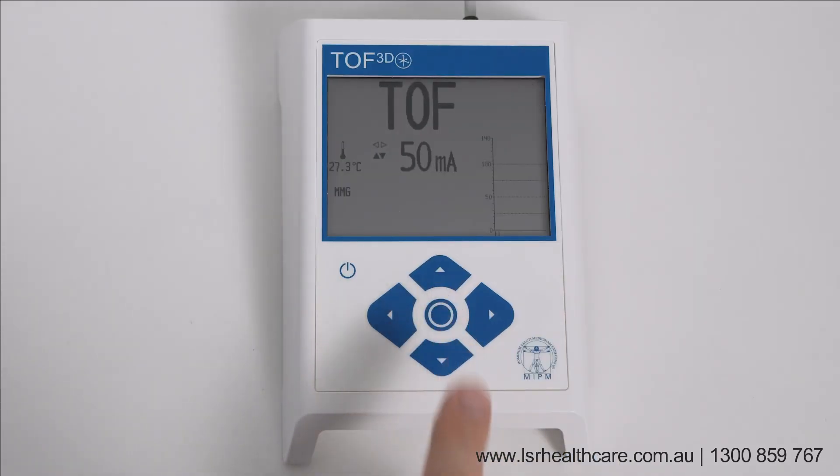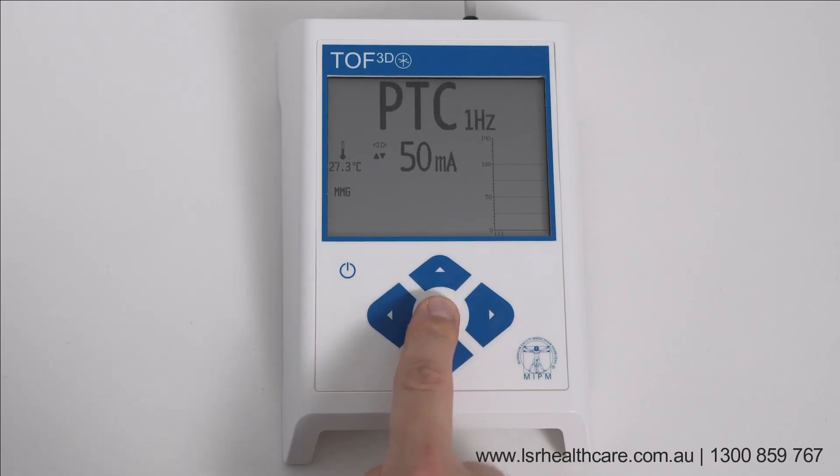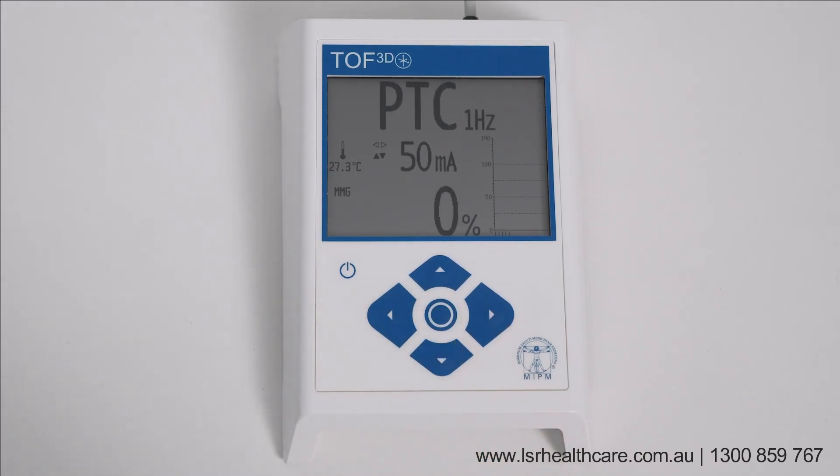Post-titanic count, or PTC. If TOF count was zero, use PTC to evaluate the deep neuromuscular block. Start PTC by pressing the center key for one second. After a successful pretest, the PTC starts. After a successful PTC, the monitor goes back to TOF mode.